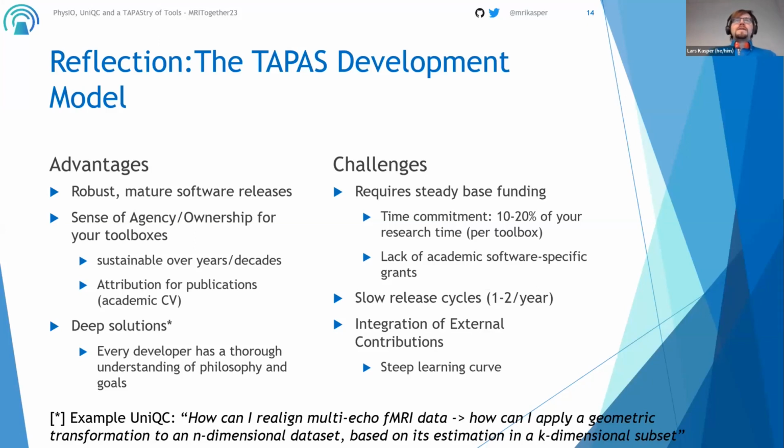And what I find also is that it offers deep solutions. So every developer who's in there has a thorough understanding of the philosophy and goals of what we're doing in TAPAS. And when you give this example, instead of asking, how can I realign multi-echo fMRI data, Saskia and I developed rather a general solution for how can I apply any geometric transformation to an n-dimensional data set based on its estimation of k-dimensional subsets, right? So these are the things you typically only can do if you have a deep understanding of what the tool is doing. The challenges of this development are also considerable.